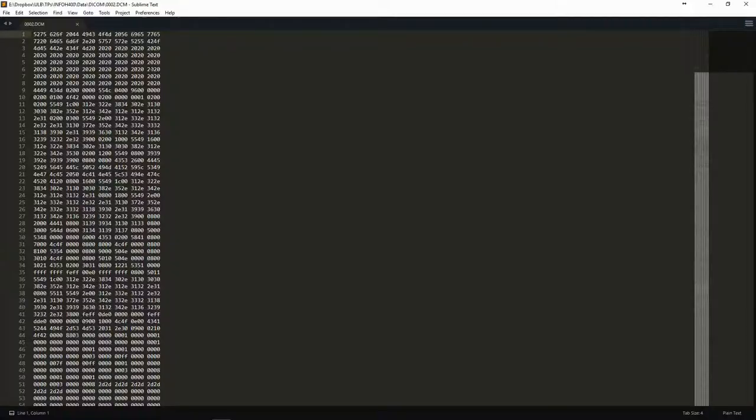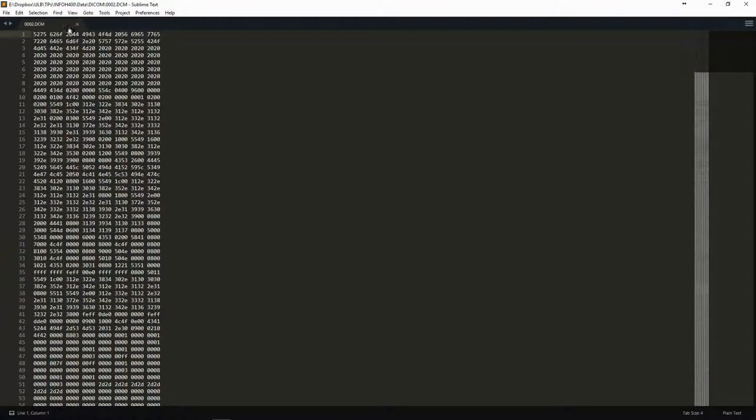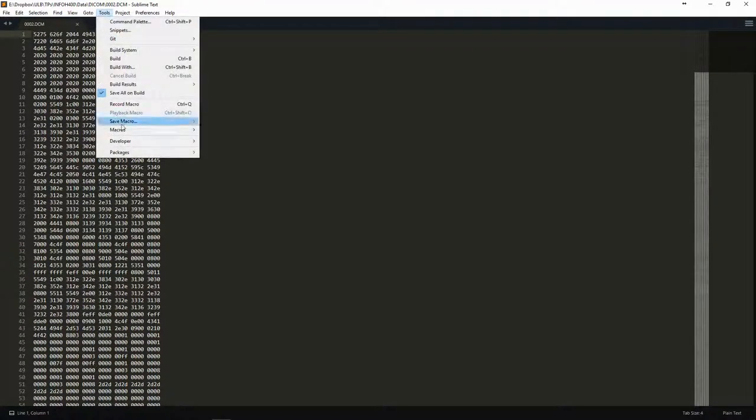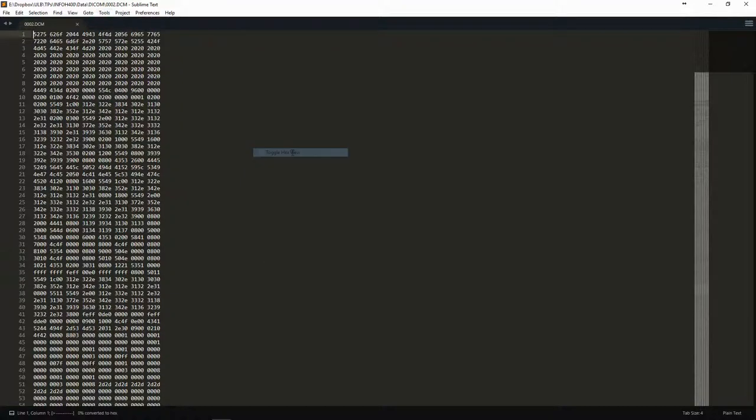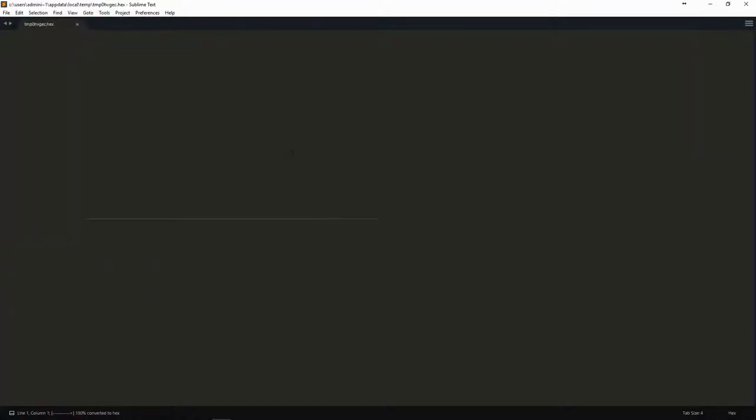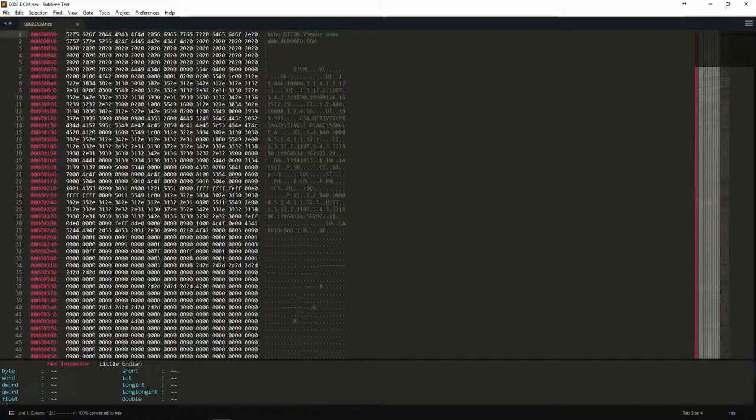Let's have a look inside the DICOM file. DICOM files are binaries. We can open them with any text editor, but if we want to make sense of what they contain, we need an hexadecimal editor. Here we use Sublime Text, which has an hexadecimal viewer plugin.